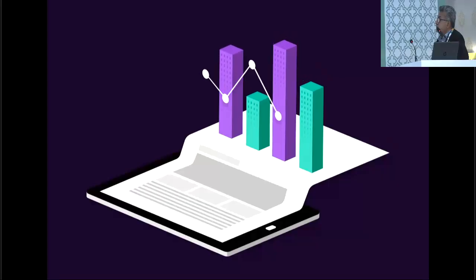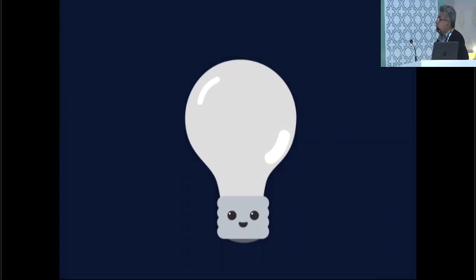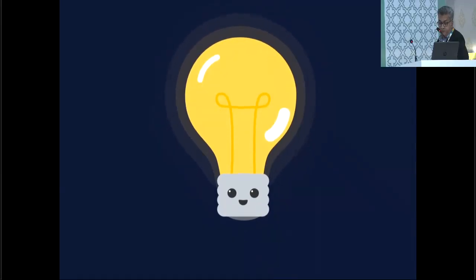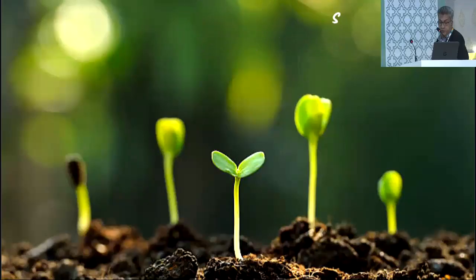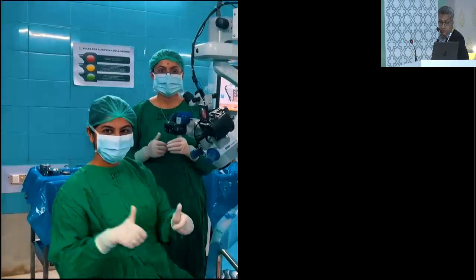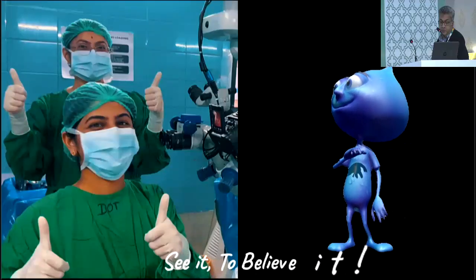We also utilized these videos to counsel patients, demonstrating how the MIGS procedure enhances aqueous outflow. This visual approach significantly improved patients' understanding of the procedures compared to previous methods. Hence, we recommend all budding MIGS surgeons to use our long-trusted friend Mr. Blue to make their life easier. See it to believe it.